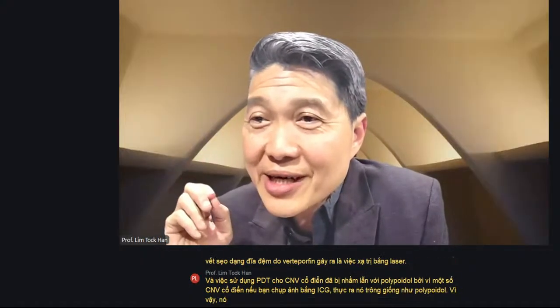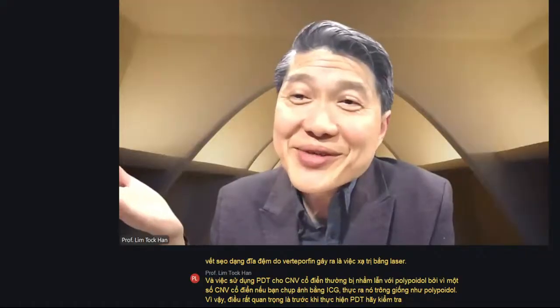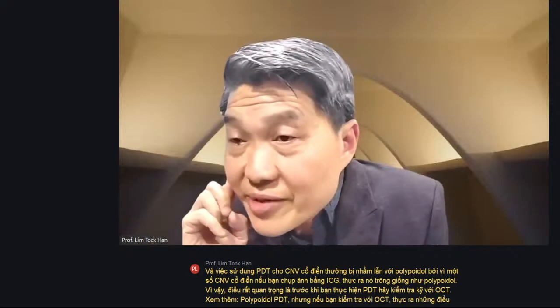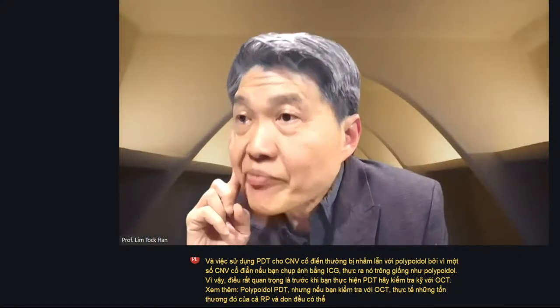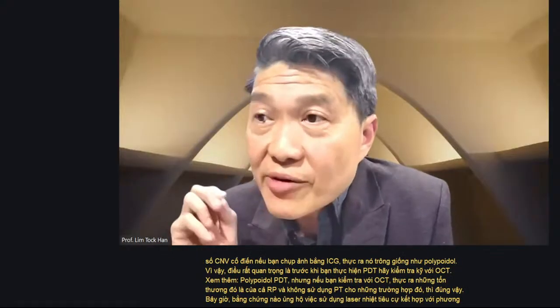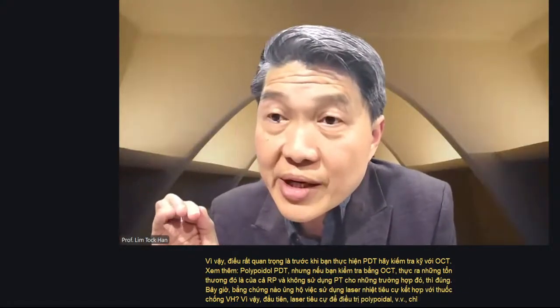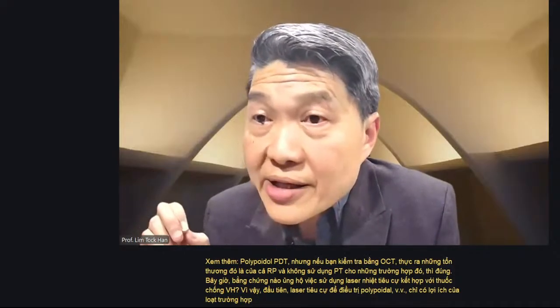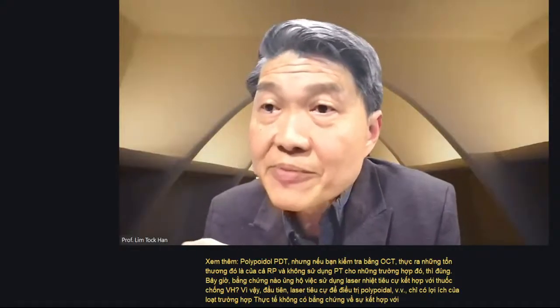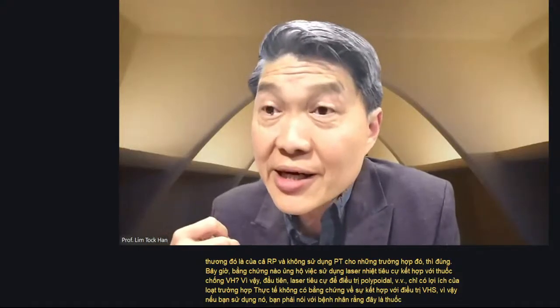So it's very important, before you do PDT, to double check with the OCT. You see, oh, polypoidal, PDT. But if you check with OCT, those lesions are above the RPE, and you shouldn't use PDT for those cases. Now, what evidence supports the use of focal thermal laser combined with anti-VEGF? For focal laser for treatment of polypoidal lesions, there are only case series. There's actually no evidence of combination with anti-VEGF treatment. So if you use it, you have to tell the patient this is an off-label way of using treatment.